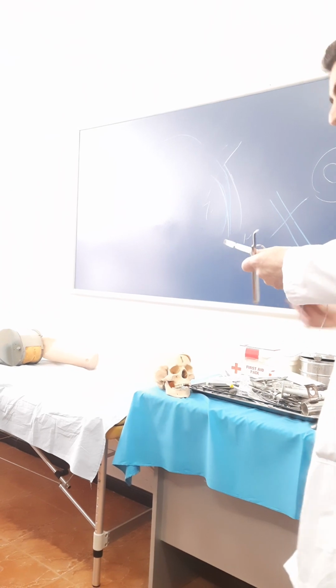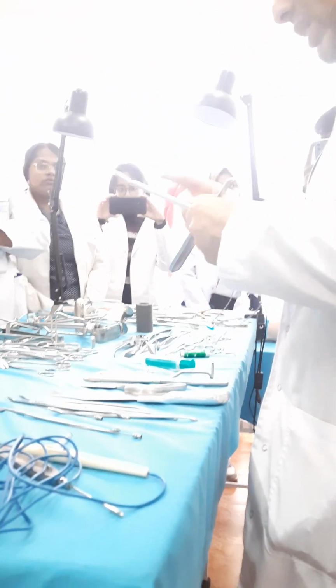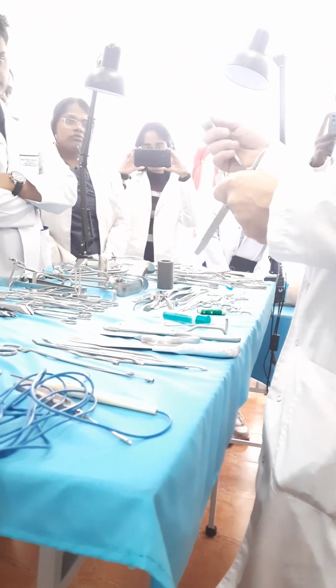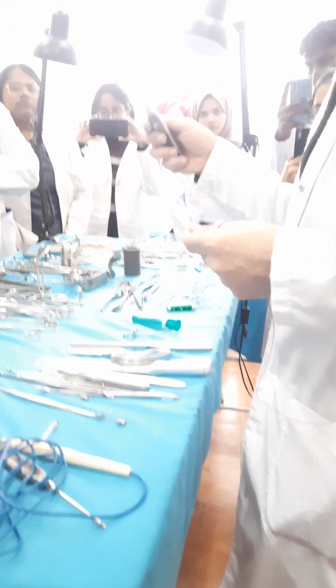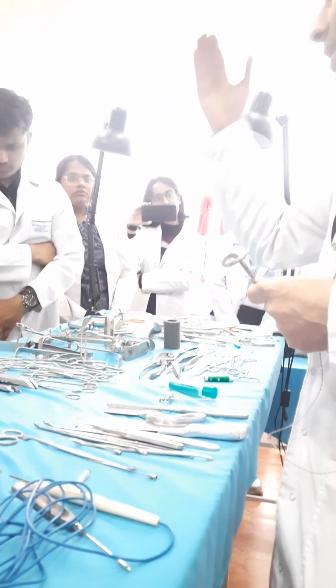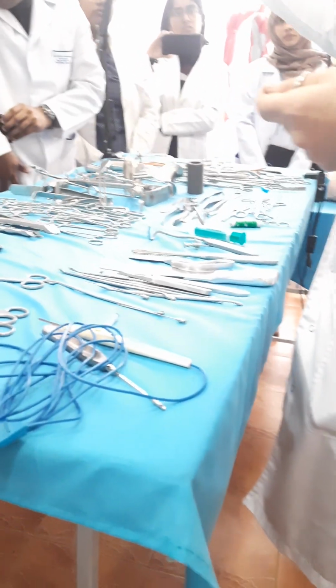As I remember the name of this instrument, we call it the raspatory. Exactly this one we call the Farabeuf raspatory. It can be straight, it can be curved. Curved is for tubular bones, straight is for flat bones. This is also a raspatory, but we call it the rib raspatory, the Doyen rib raspatory. By sliding movements, we clean the periosteum from the surface of the bone. Why is it necessary? Again, to not damage vessels.